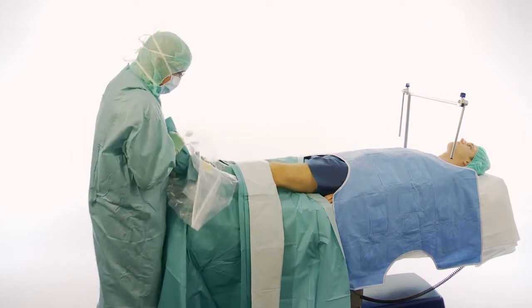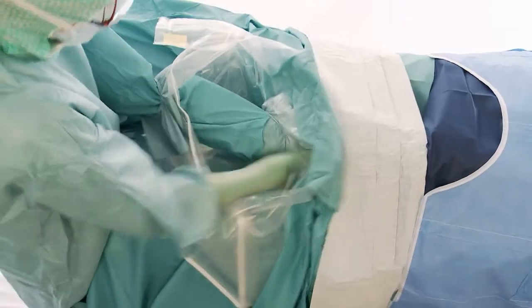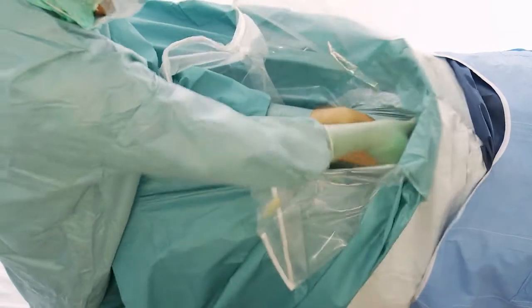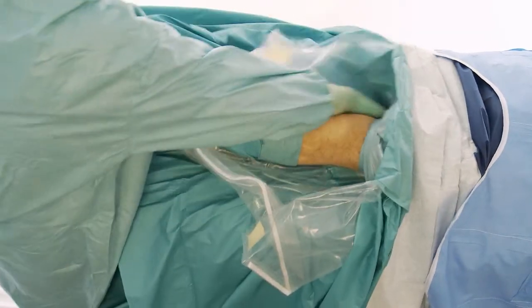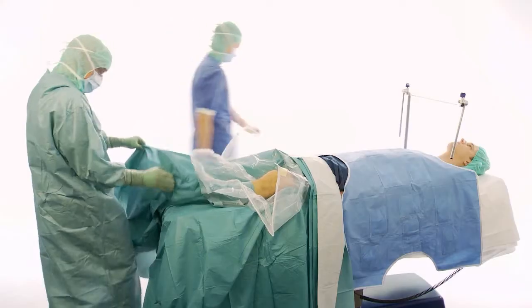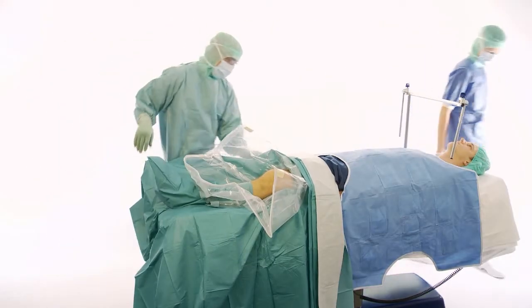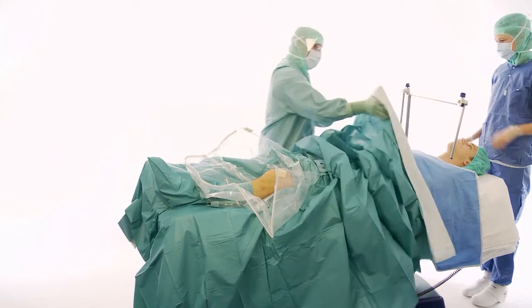Unfold the lower part of the drape under the patient's leg and place the two elastic openings around the knee. Unfold the upper part of the drape fully towards the head.